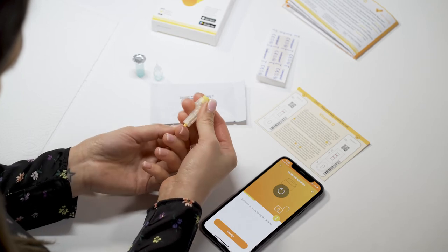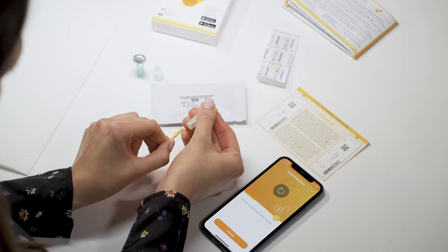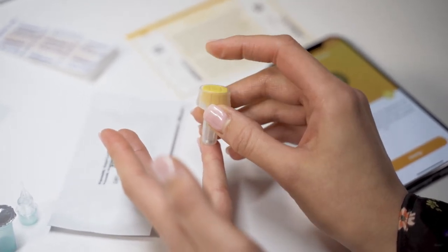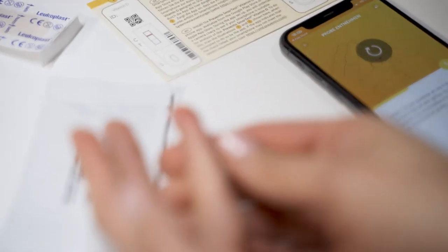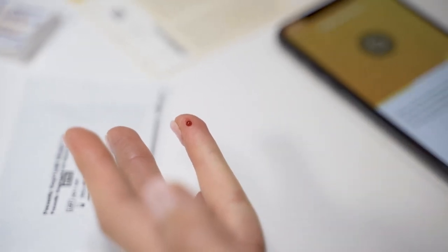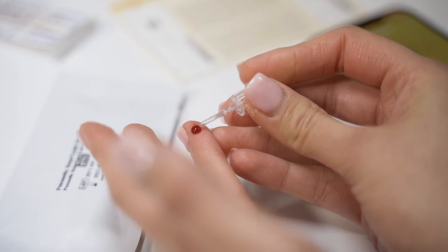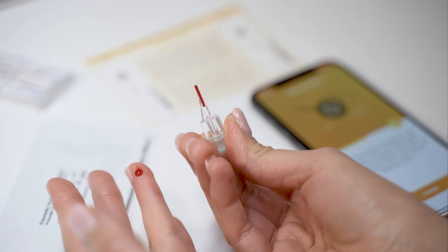Disinfect the area with a cleaning cloth and then allow the cleaning liquid to dry completely. Pull out the safety cap of the lancet with a half turn. Be careful not to accidentally release the disposable lancet. Hold the lancet firmly against the cleaned fingertip while pressing the yellow button. This will cause the short needle of the lancet to pop out for a split second and puncture the finger. Then massage the finger in the direction of the puncture until a large drop of blood has formed.